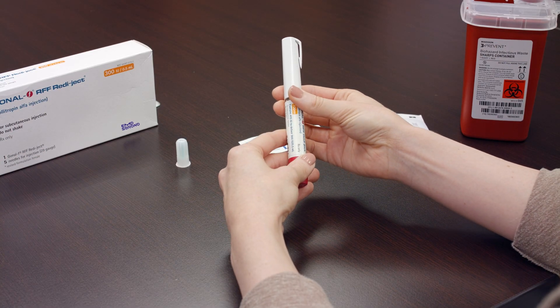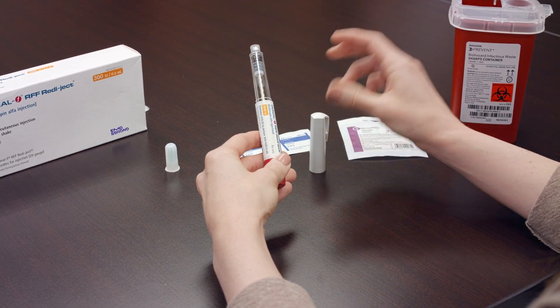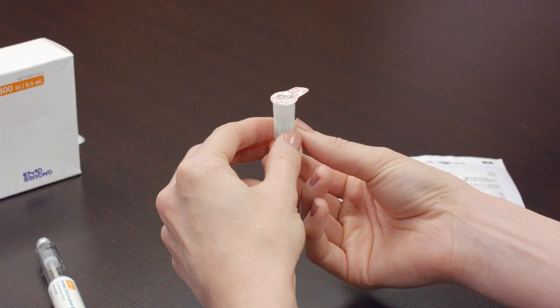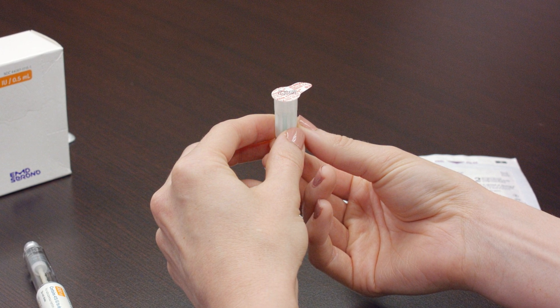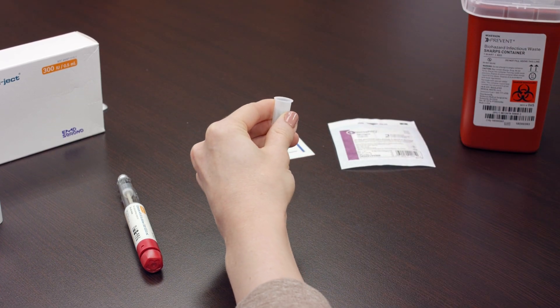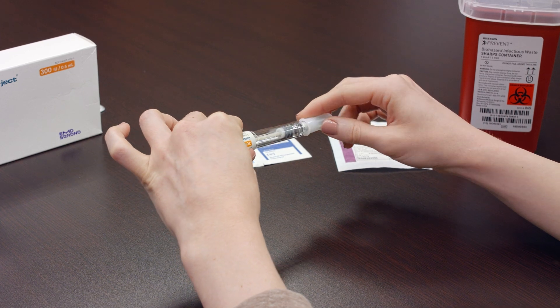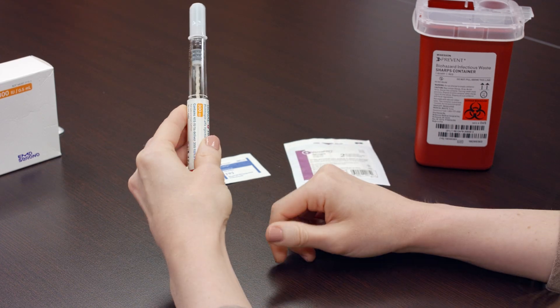Hold the Gonal F pen and remove the white cap portion of the pen and place it off to the side. The disposable needles provided with the Gonal F pen are single use only. Make sure to use a new, clean needle for each injection. Remove the seal from the disposable needle and while leaving it in the protective cap, twist it firmly into the yellow end of the pen. Do not let the sterile needle come into contact with anything, even yourself.